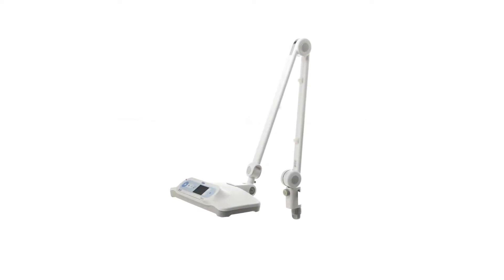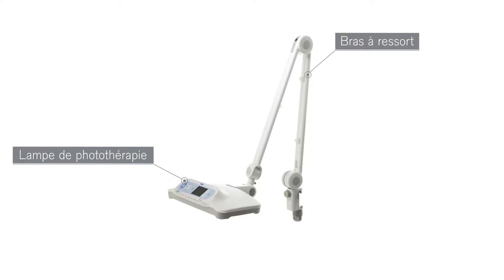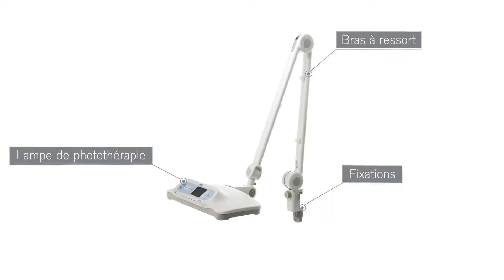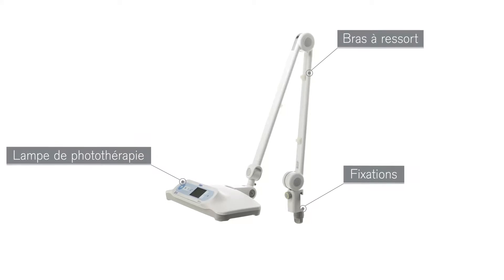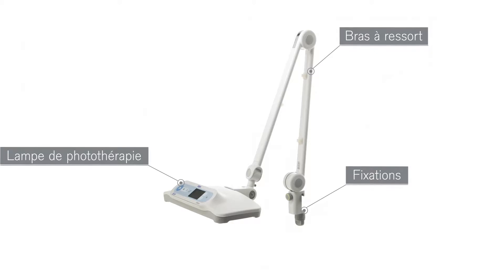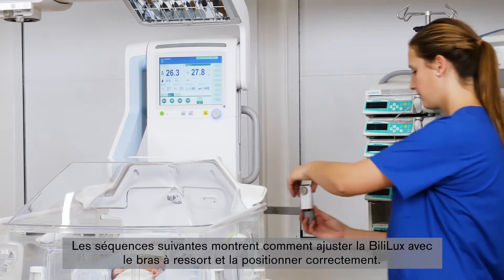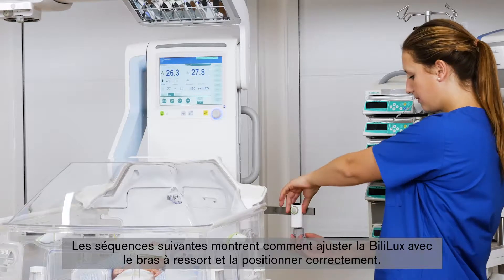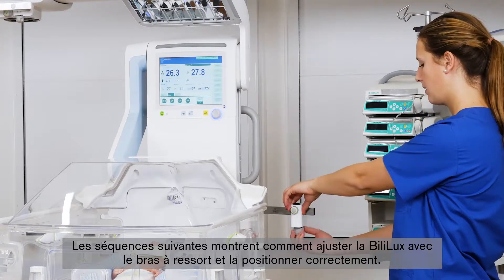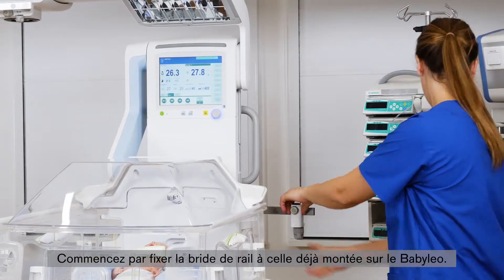The Bililux with spring arm consists of the phototherapy light, an adjustable spring arm, and mounting provisions that allow the Bililux to be used with various Draeger warming therapy devices and ceiling supply units. In the following scenes, we will show you how to adjust the Bililux with the spring arm and how to position it correctly. First, attach the rail clamp to the clamp already mounted at the Baby Leo.